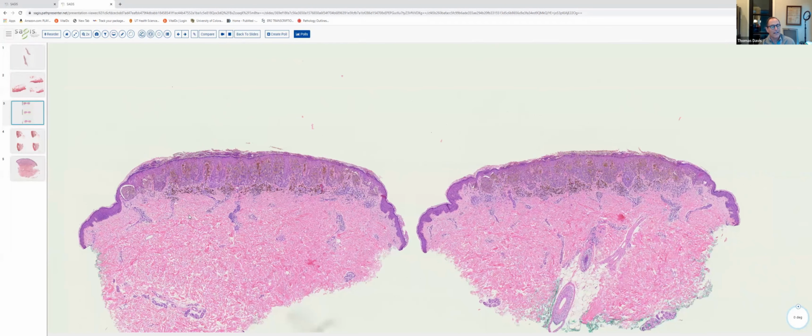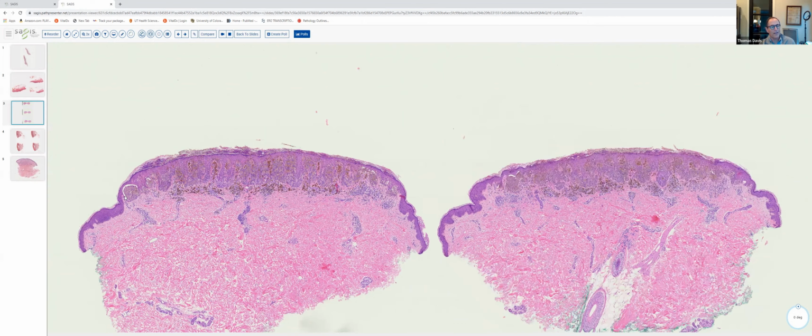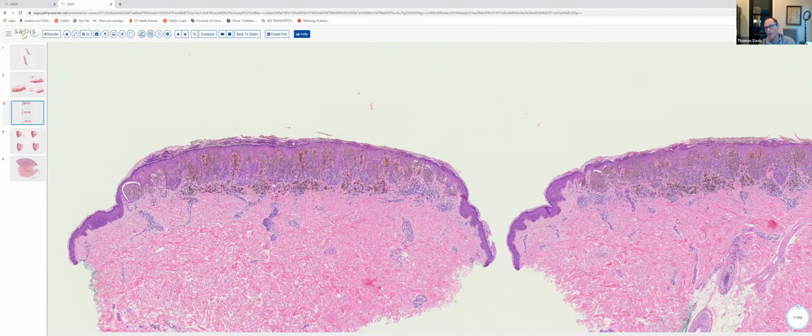The lesion is clearly symmetric. If you draw a line halfway down the specimen, one could see that the right and left halves look the same. This lesion is very well circumscribed, ending in a nest on either side.